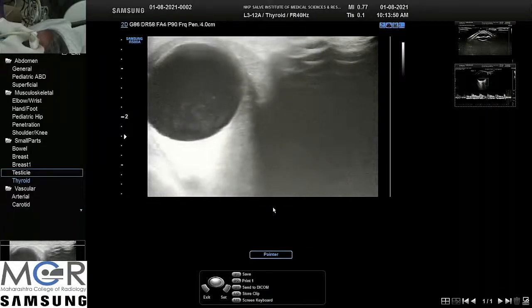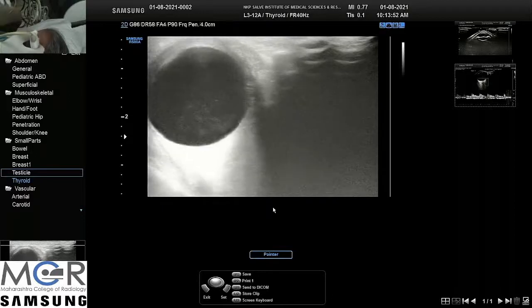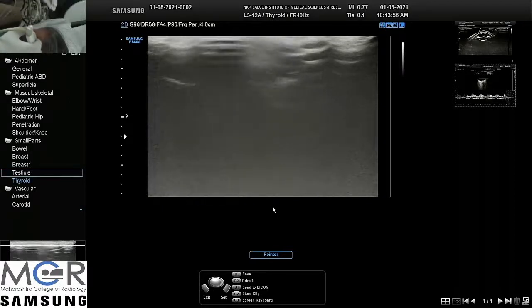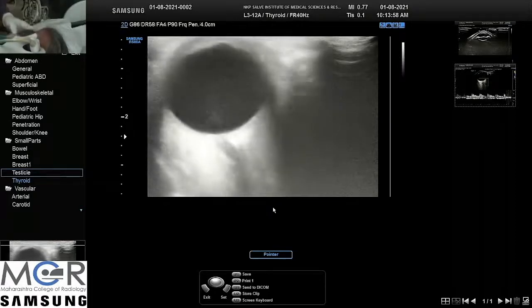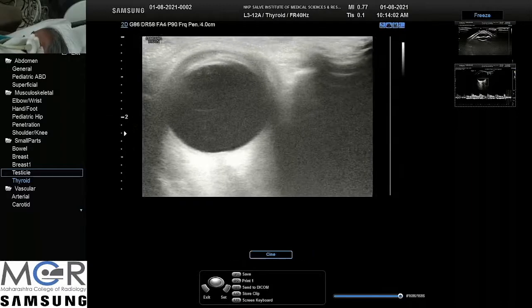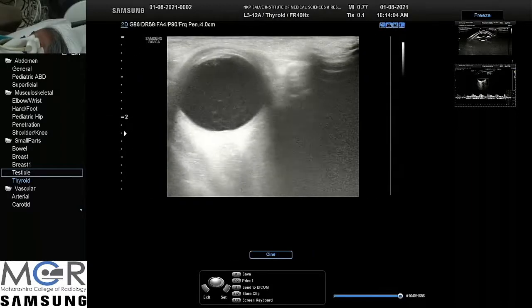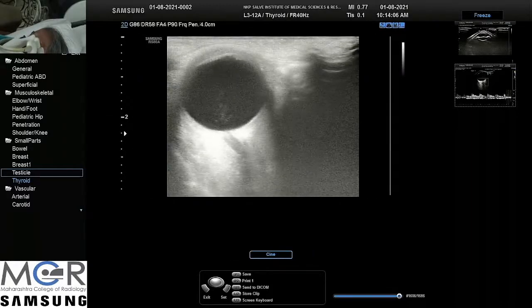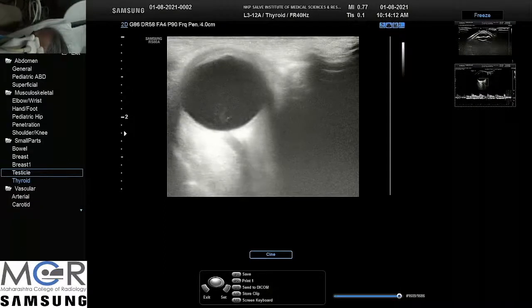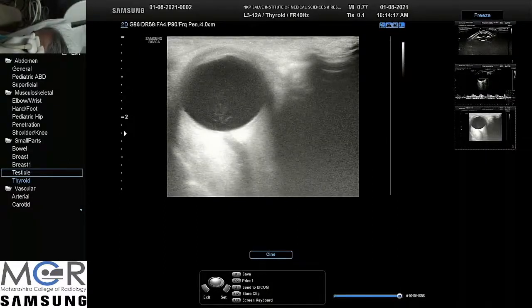She is not able to move the eyeball, but we need to make her. Now you can see that. See, they are moving. Can you appreciate this? The fine internal echoes, they are moving, and this indicates that there are free mobile internal echoes in the posterior vitreous.